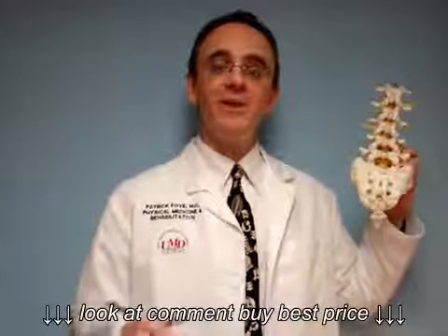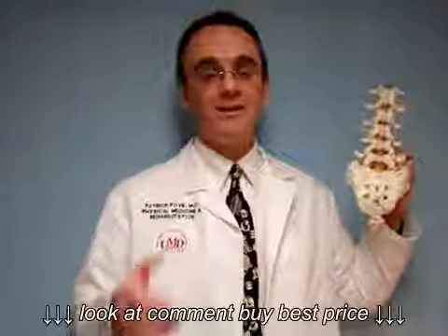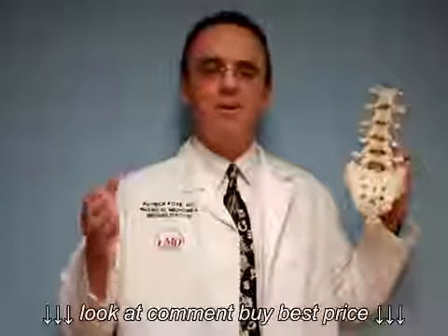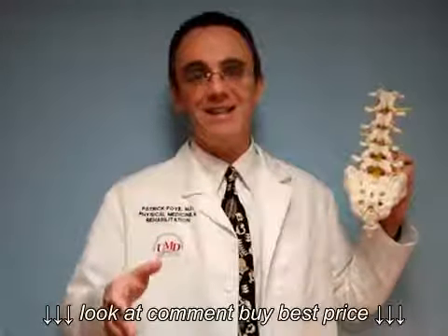Hi, this video is about how to tell if your MRI images included the coccyx or tailbone. This is important if you have tailbone pain and if your doctor sent you for an MRI as part of the workup or testing being done for the tailbone pain. You want to know, did the MRI actually include the tailbone in the first place? It seems simple, but let me tell you, a lot of times it doesn't get included.